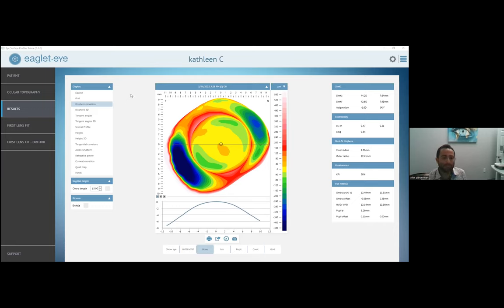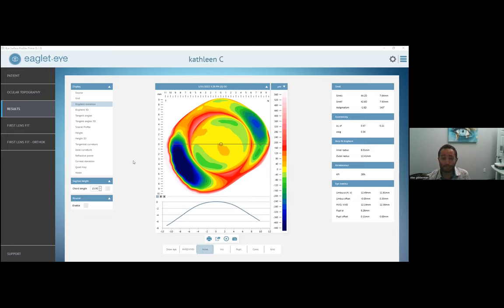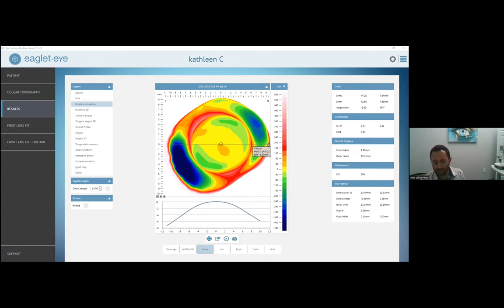Here's an actual patient of mine we saw about a week ago. She was a 66-year-old female referred to us because the cornea specialist couldn't correct her to 20/20. She had some mild cataracts but not significant enough for surgery, and there was a little irregular astigmatism on topography — though not keratoconus. We were actually able to get her to 20/20 with sclerals. The bisphere elevation map is your home screen — this inner circle represents the cornea and the outer zone is the sclera.